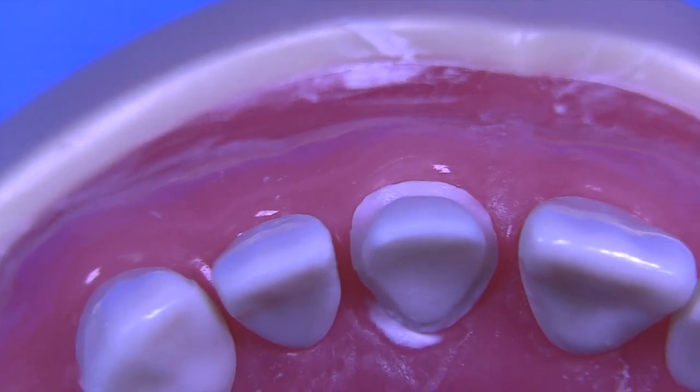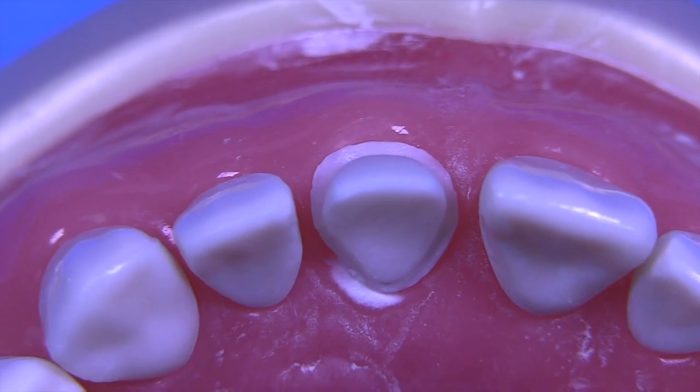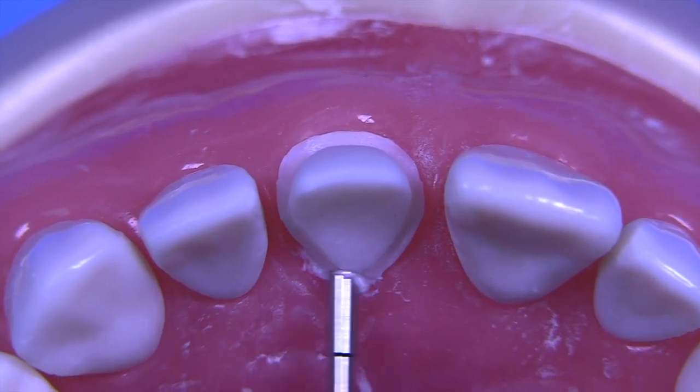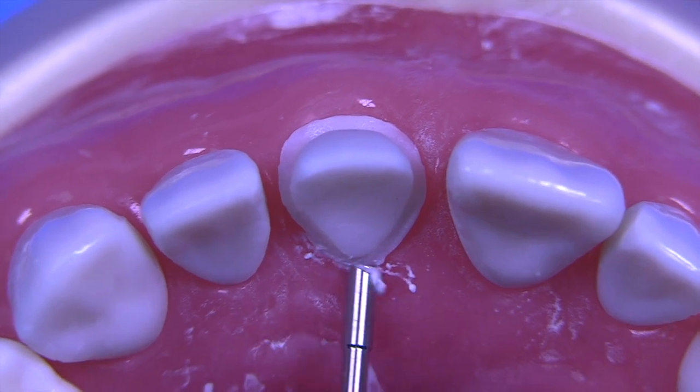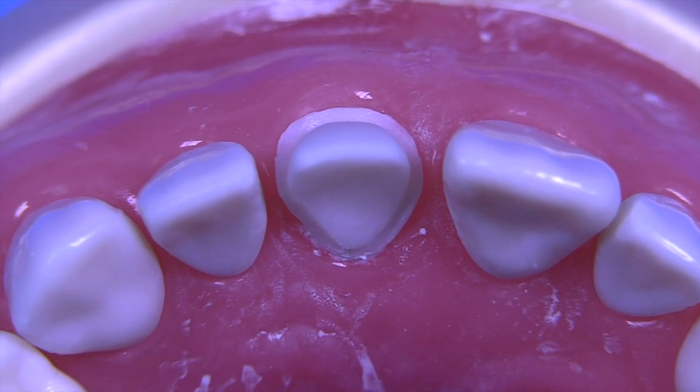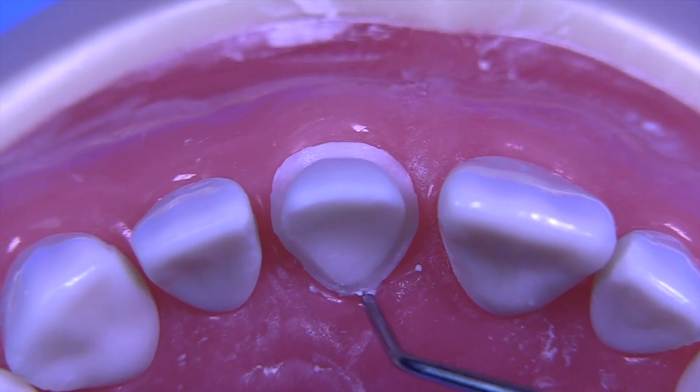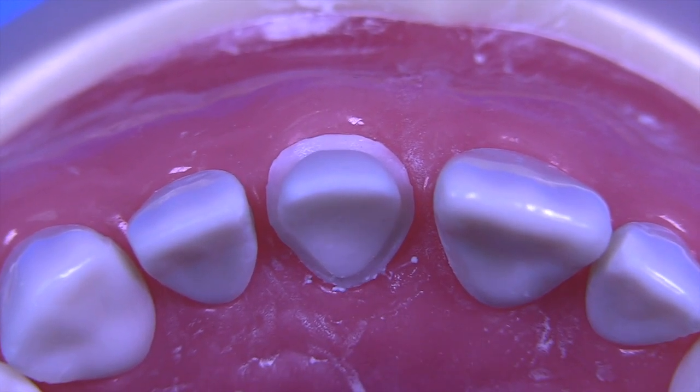Let's take a look at it from the occlusal view. And in this particular view, we're looking at the preparation in terms of its taper and draw. You can see that there's a little bit of debris here. I need to remember to mention that when I give you your final grade on the operative environment. But basically that kind of debris really needs to be removed.